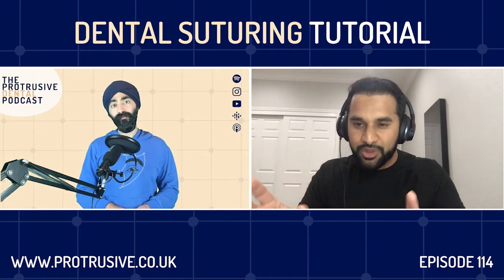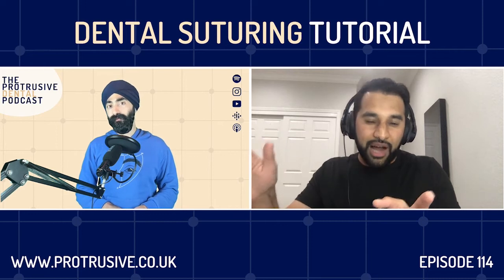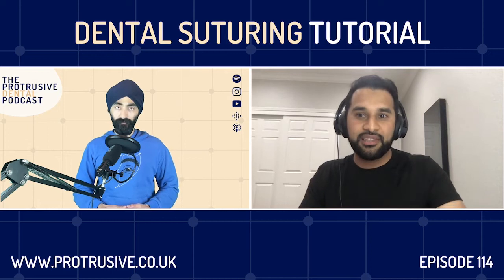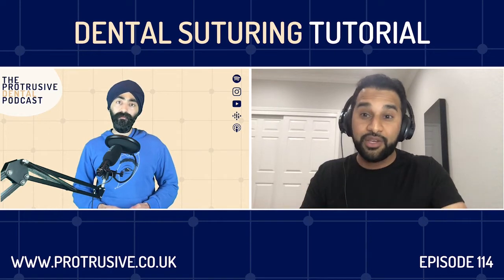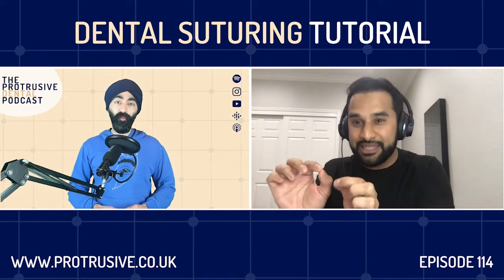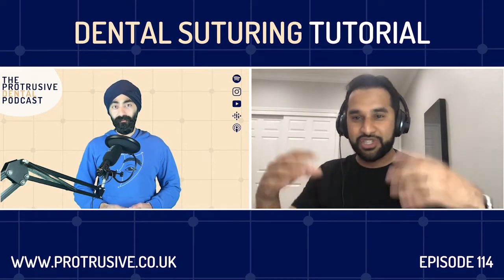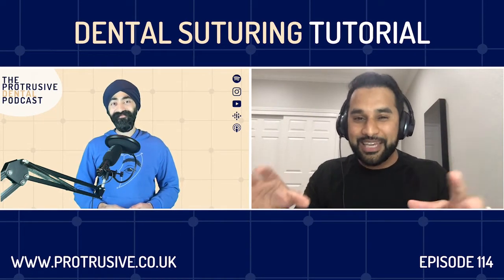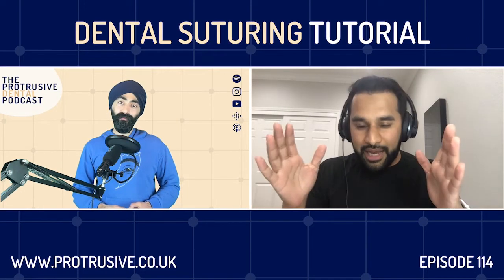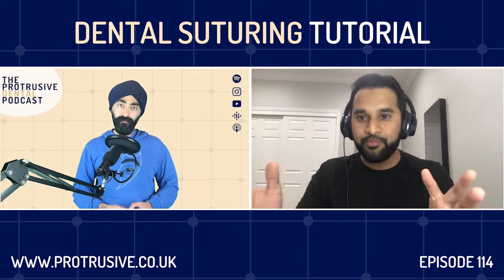generally in dentistry, we use between 3-0 and about 5-0, 6-0. If you get into more microsurgery techniques, say periodontists that are now using ophthalmic grade sutures for really tying that papilla gently together, they'll go even further to 7-0, 8-0 using microscopes and all of that. But let's keep it basic, right? For the surgically minded GP, I would say stick to a range between 4-0 and 6-0, right?